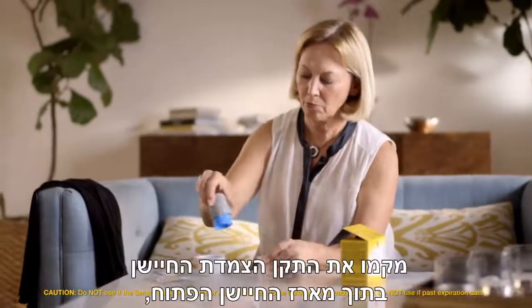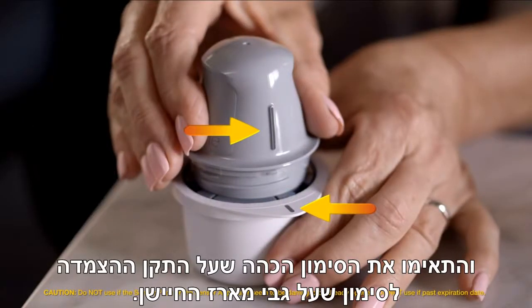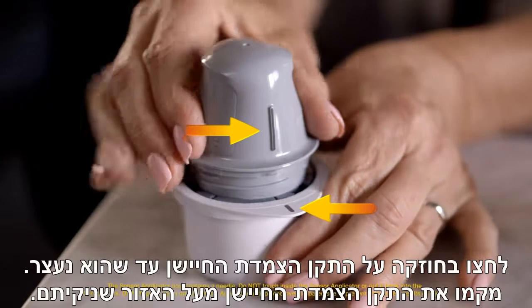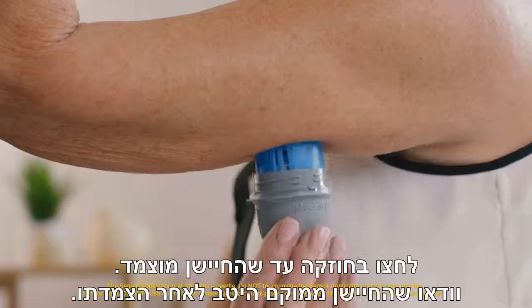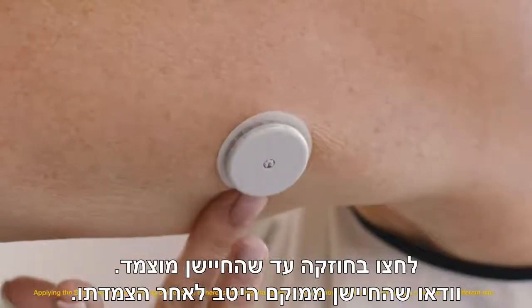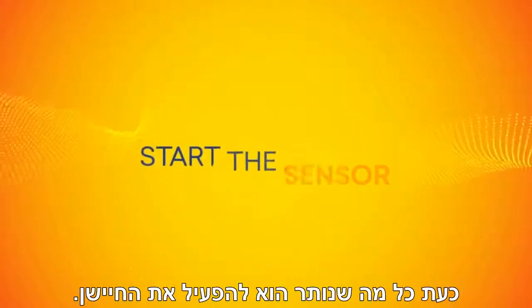Peel the lid completely off the sensor pack and unscrew the cap from the sensor applicator. Place the sensor applicator into the open sensor pack and line up the dark mark on the applicator with the mark on the pack. Then press down firmly on the sensor applicator until it comes to a stop. Simply place the sensor applicator over the site you cleaned, and push down firmly until the sensor is in place.